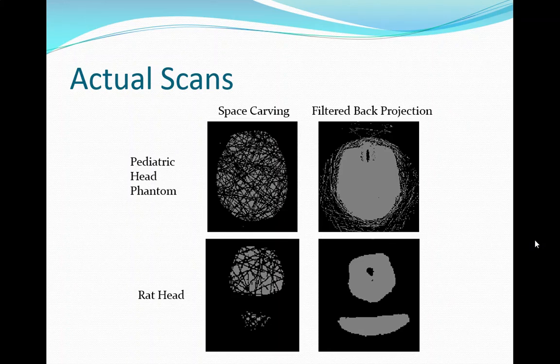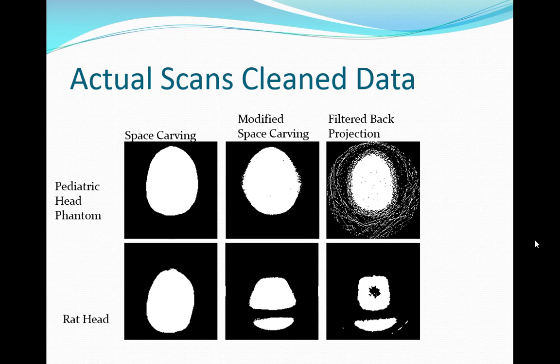So do you just do an outlier thing? So then we have to find the ones that are the nuclear interactions that are on them. So these are both from real data. And so we were able to then take this one and we cleaned it up to remove those secondary nuclear interactions, statistical check, and we modified stuff, and you can see all the problems went away at that point. And we have not had any problems since.